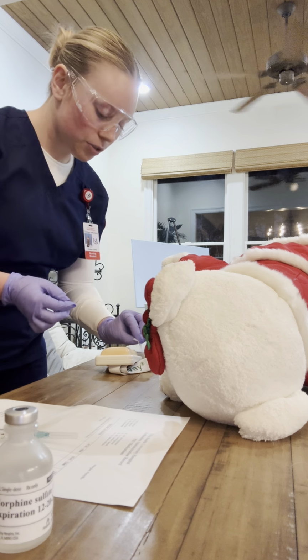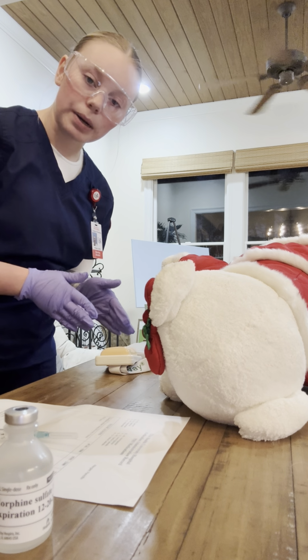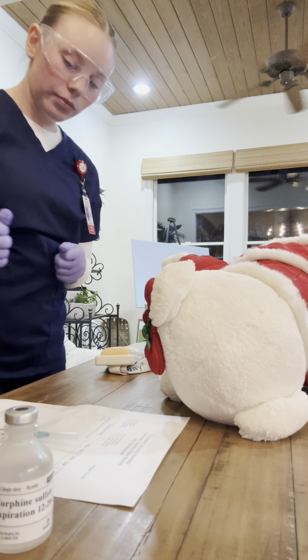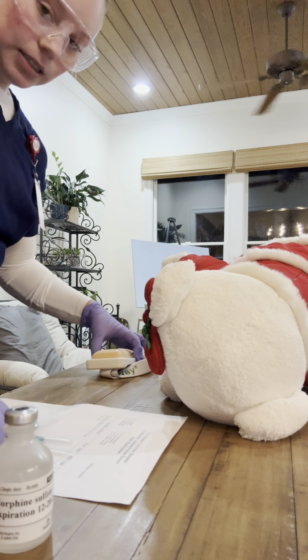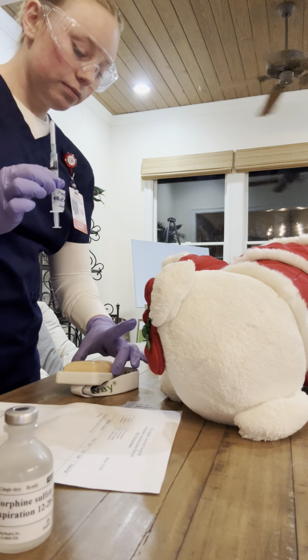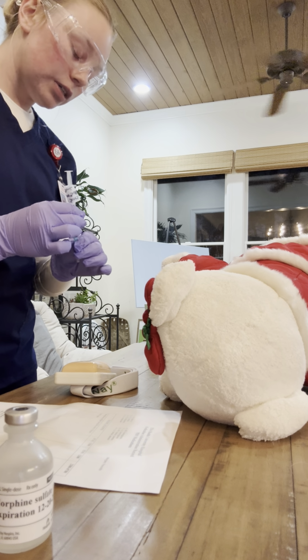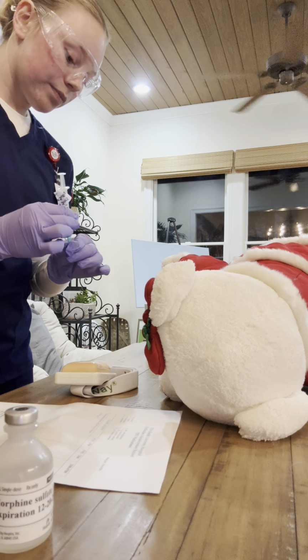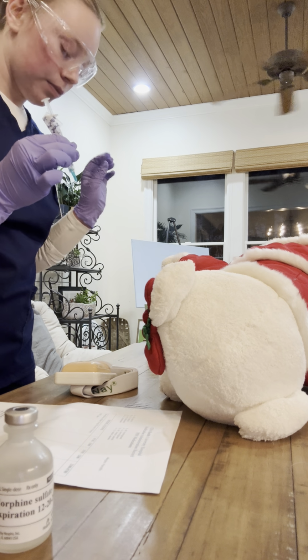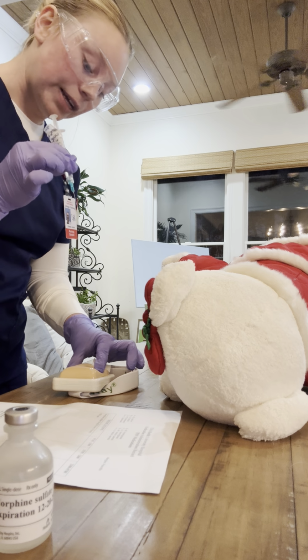All right, I'm going to leave this right here. I'm going to put the corner pointing to where I'm going to be injecting. And then next, you can see, I'm going to be taking my syringe and my needle. I'm going to open up my needle. I'm going to spread the skin and inject the needle at a 90-degree angle.